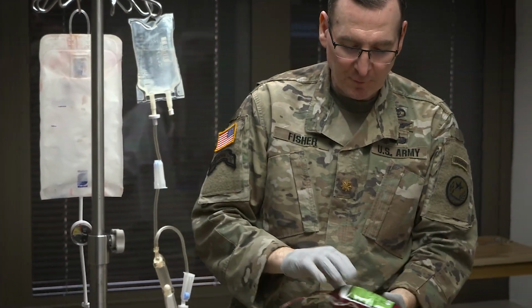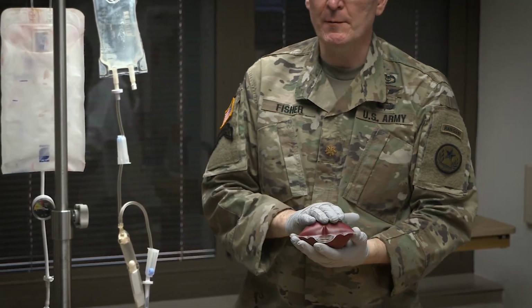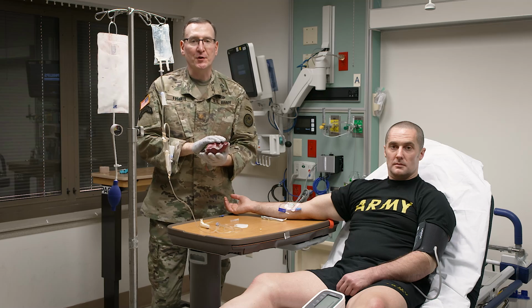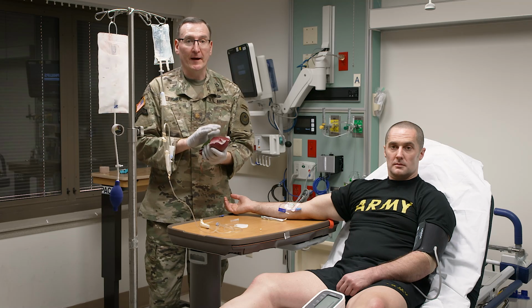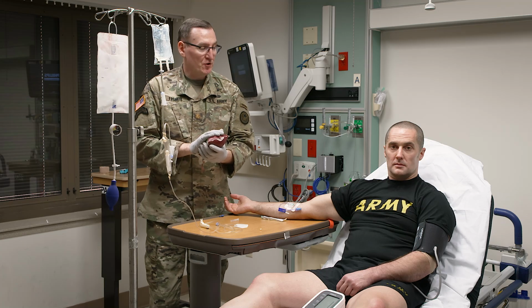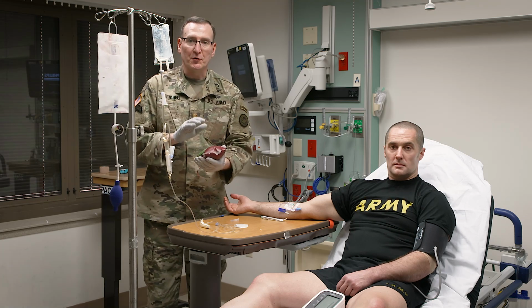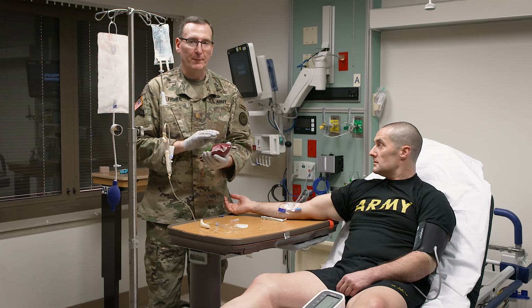The next thing I'm going to do is take my blood bag. I'm going to do a timeout, okay? Now, a timeout is used in medicine when we are going to do an intervention that has potentially high risk and adverse outcomes. So I'm going to make sure that this is the right patient, okay? I'm going to make sure that this is the right donor, okay? And then we're going to make sure that we have the correct blood type.